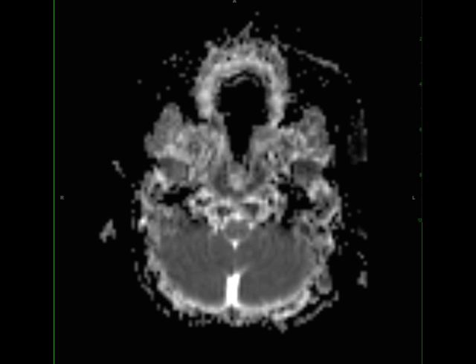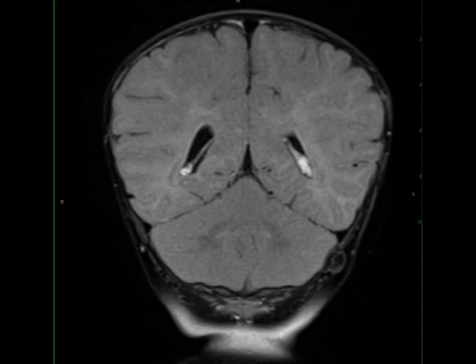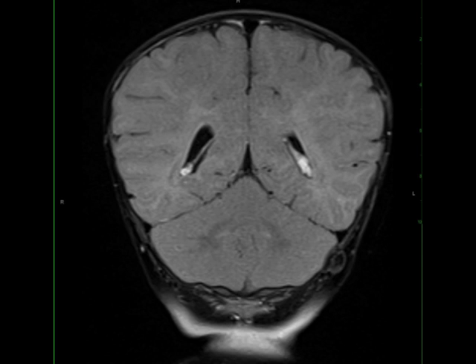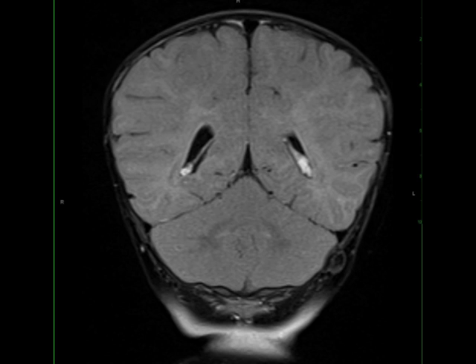The findings are compatible with an epidermal inclusion cyst. While the diffusion restriction and off-midline location favor an epidermoid, the lesion's intimate association with the underlying suture favors a dermoid cyst.